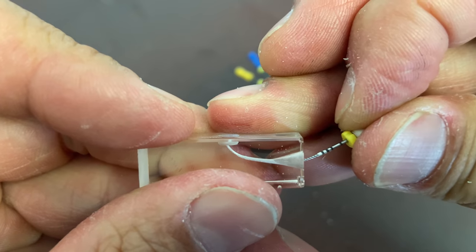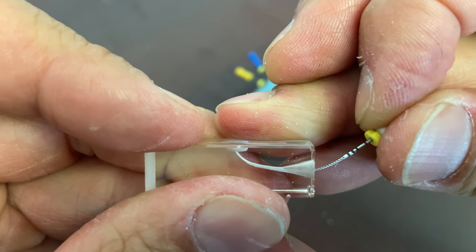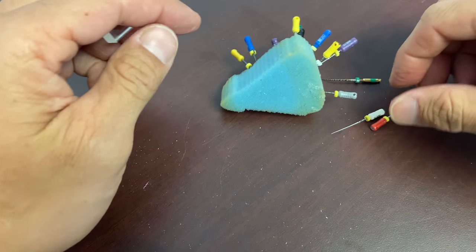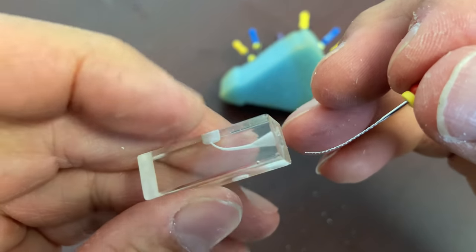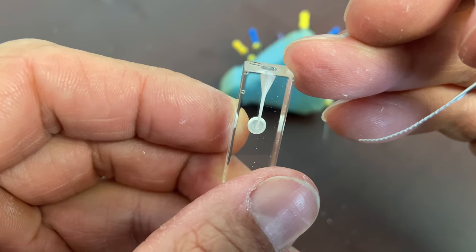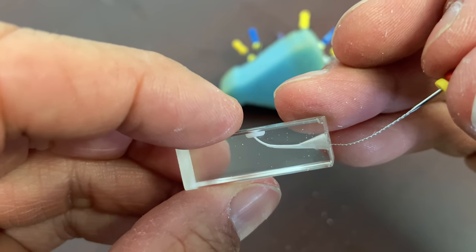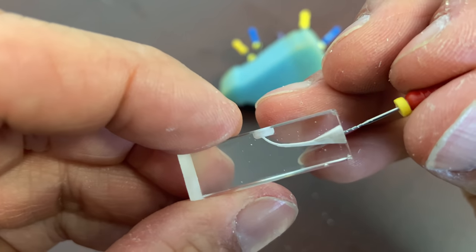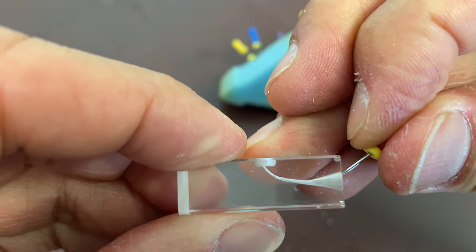Another way to use the filing technique is to try to get rid of little ledges. File that area — remember, you're only seeing two dimensions, not the third dimension. Hopefully that's helpful. I kind of rambled on a bit but wanted to show you a couple of things.